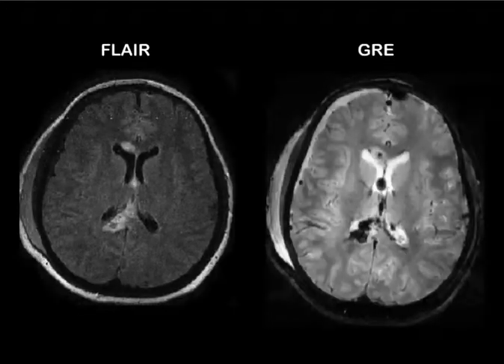So this is a few slides about anatomy, and here you have the FLAIR sequence, which is essentially like a T2 sequence with the signal in the CSF nulled. And you can see that using this sequence in this particular individual after TBI, there is significant damage involving both the genu and the splenium of the corpus callosum. This same individual underwent a gradient recalled echo, and this is a sequence that is very sensitive to hemoglobin breakdown products.